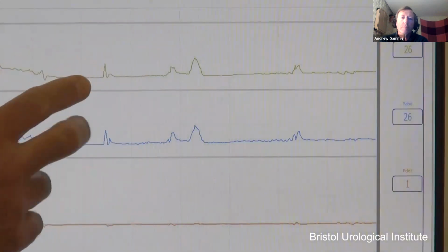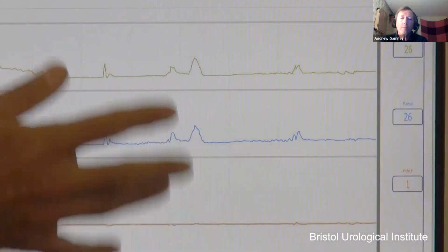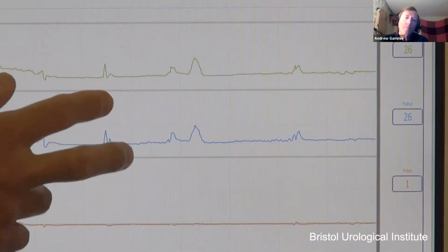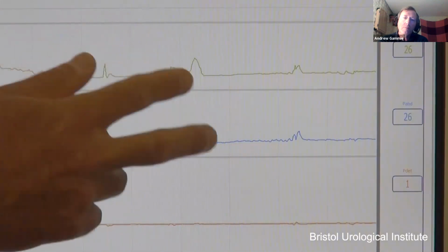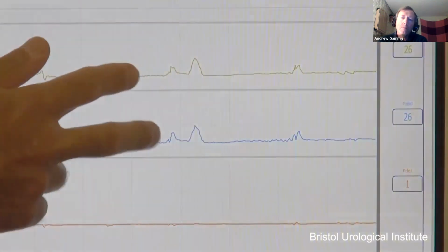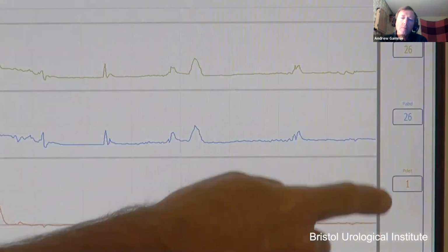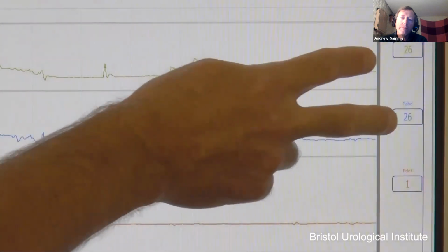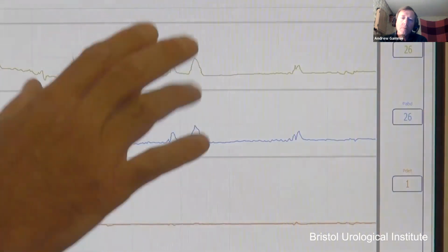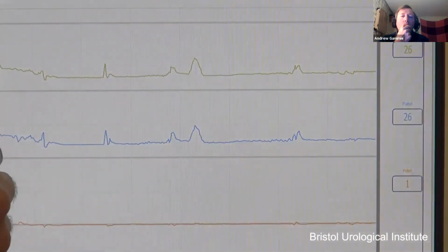The first one is the resting pressure. Once we've zeroed to atmosphere, the resting pressure inside the patient needs to be within standard levels. And for a seated patient, it would be around this, 26 centimeters of water on both lines, which means that your P-det is pretty near 0 because the resting pressures are equal. So that resting pressure is in the normal range and that quality check is passed.